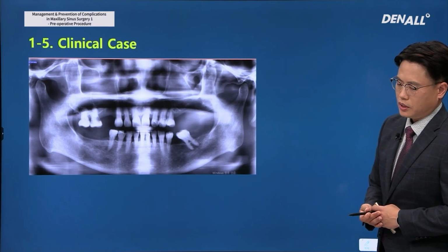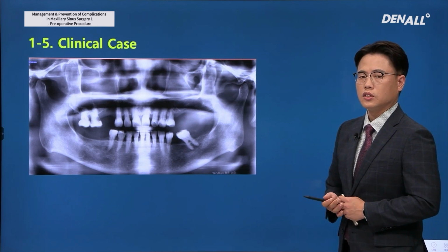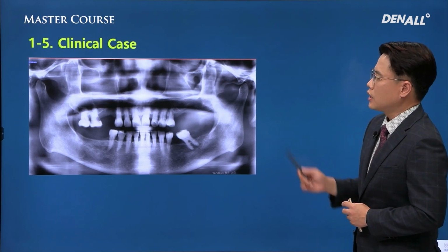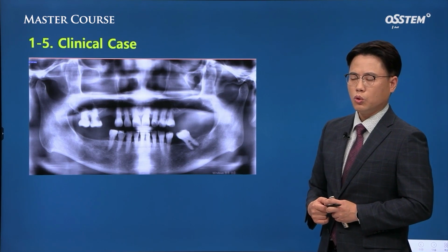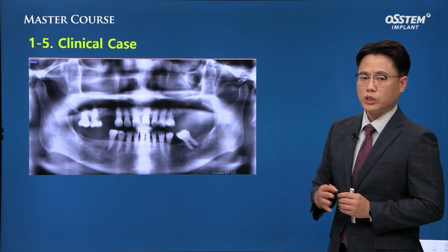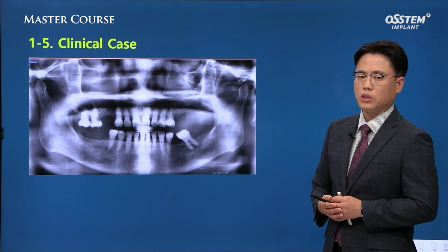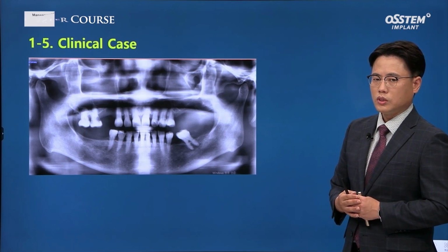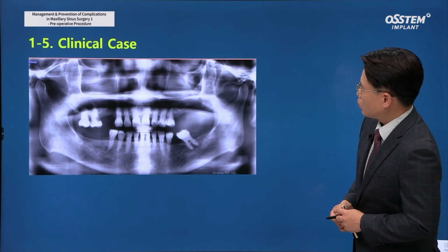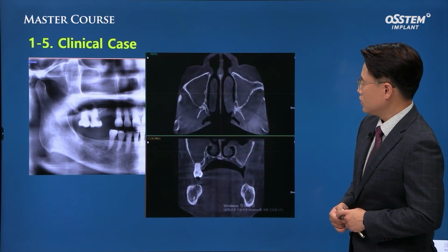This was a female patient in her 80s. She experienced sinusitis symptoms, and she visited a local dental clinic first. She was told that there was sinusitis on both sides. She was told to do surgery at ENT. She went through all the surgery, and she heard that she was safe to receive implant surgery and came to my hospital. On panoramic image, it looks a bit hazy, and in some sense it looks okay.